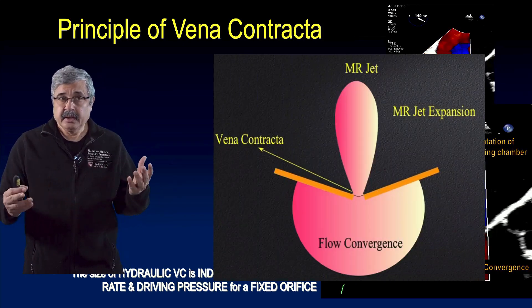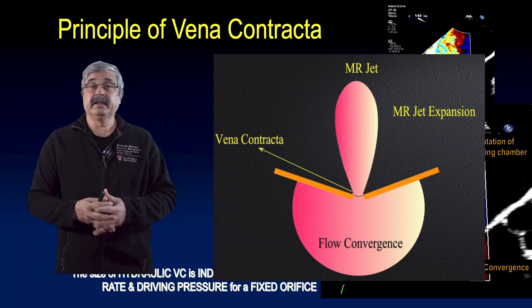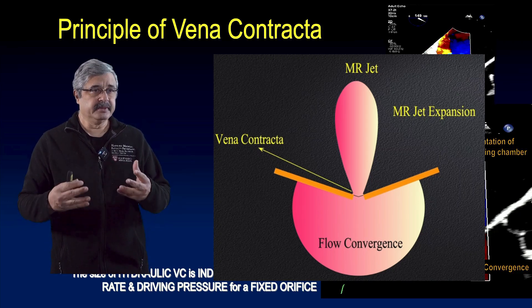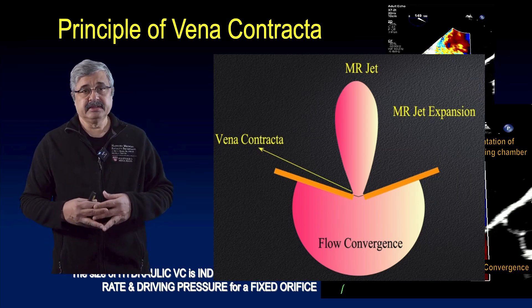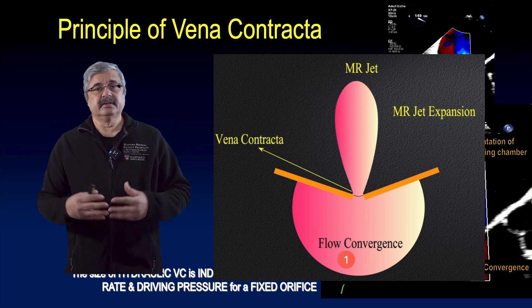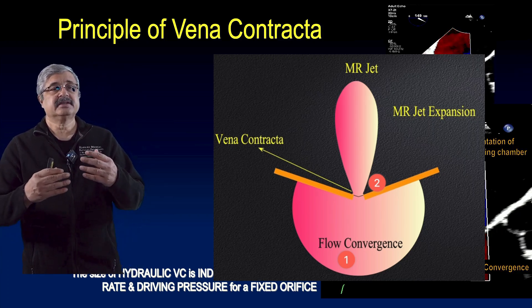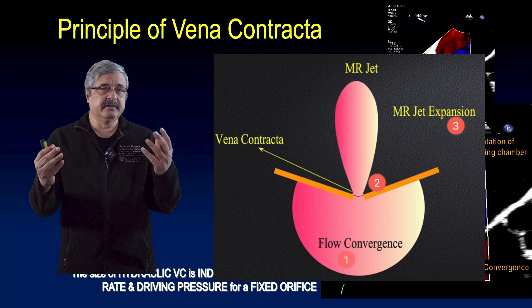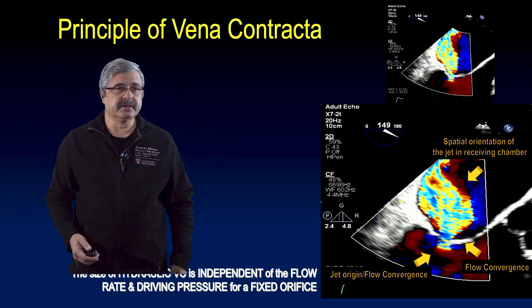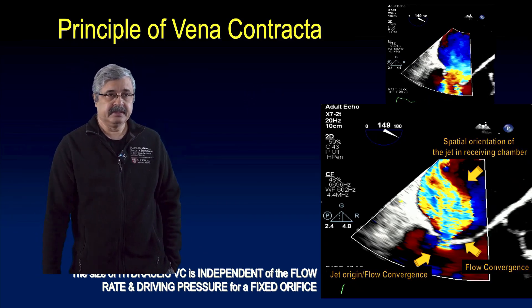Vena contracta has three components that must be demonstrated for a valid measurement. Number one is jet origin and flow convergence. Second is flow contraction — where the flow becomes narrowest. And lastly is the spatial orientation of the jet in the flow chamber: flow convergence, flow contraction, and flow expansion in the receiving chamber, which in this case would be the left atrium.